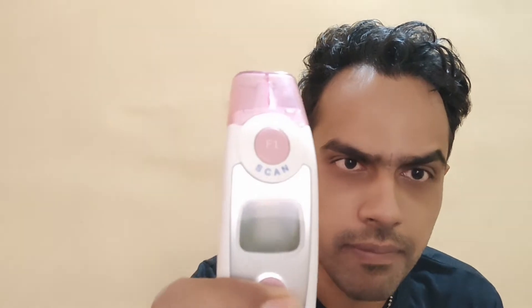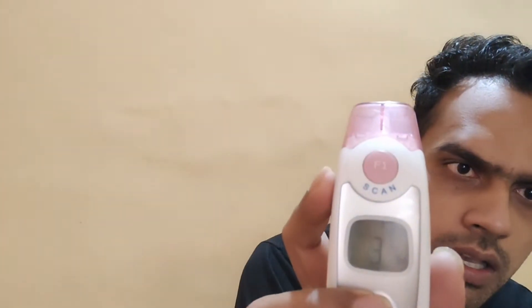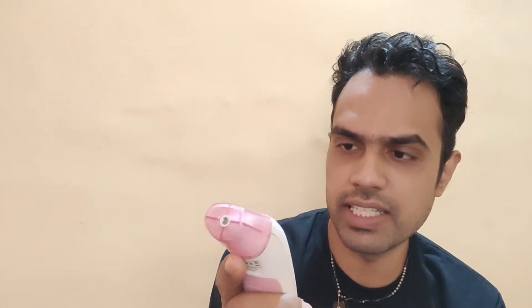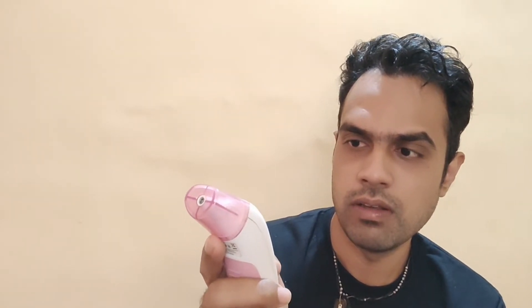It also stores the readings. If you ever have to check a stored reading, press F2 and hold it for some time until you see an M appear — that M shows it's in memory mode. Then you can check the readings. It stores around 20 readings or so.